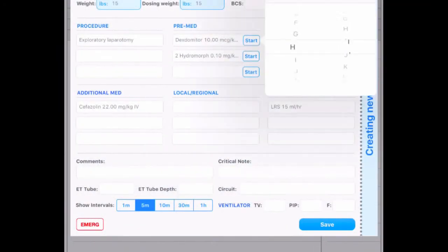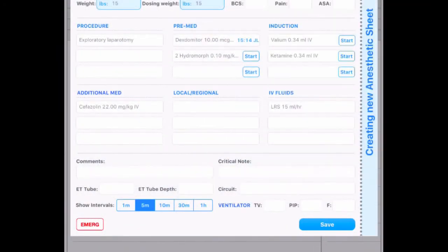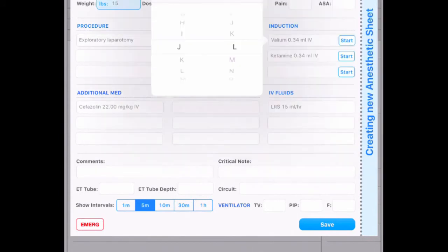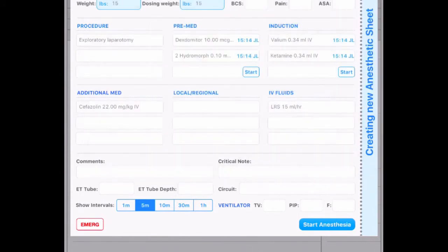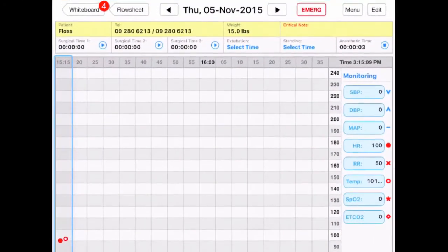Once you have given the medications, hit the start button to initial and timestamp the action. After induction, press start anesthesia. You are now taken to the anesthetic sheet.